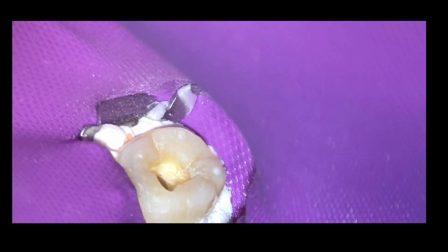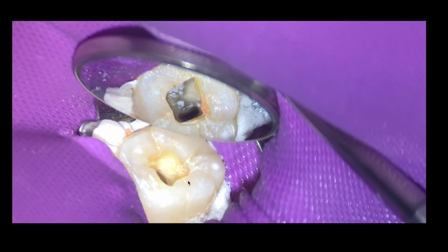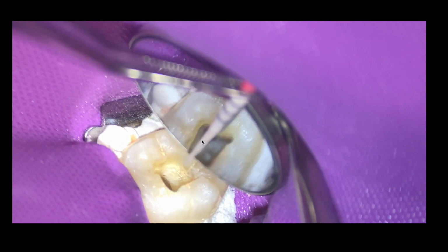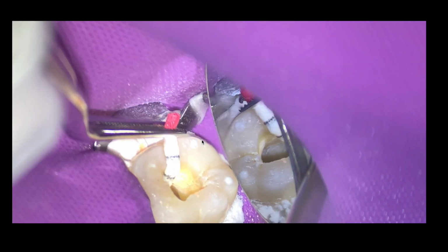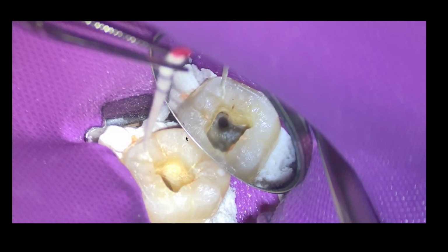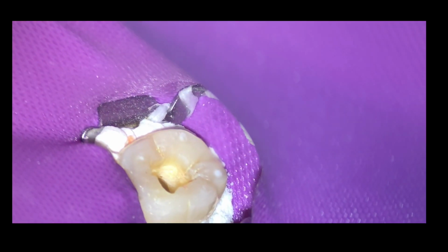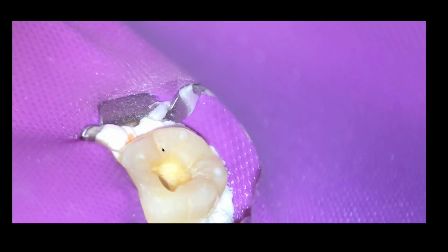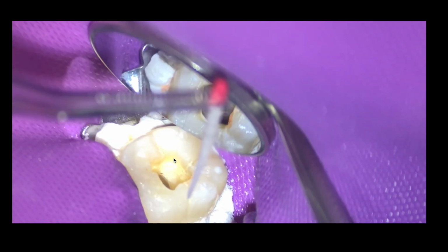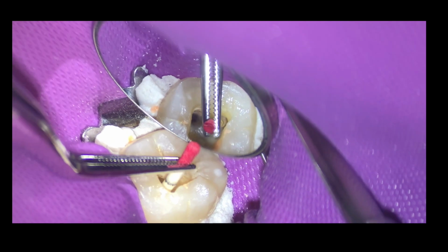Sodium hypochlorite. So I'm going to place my paper points in, blow air on it, and what it does is it wicks. The idea is to wick some of the moisture of the sodium hypochlorite up through the paper point as the air blows over. Now, does that happen? I have no idea. So I'm just checking to make sure my paper points are dry or wet, moist, by placing them on the tooth. I don't have patency, so I'm not going to be using it to check my working length. We're just placing it down to make sure we can get that dry.